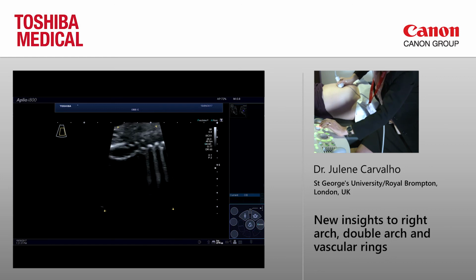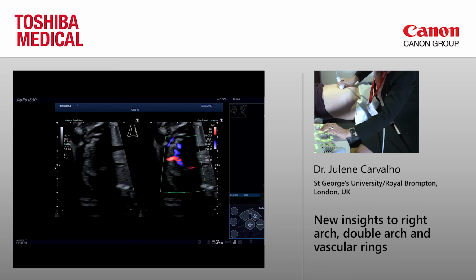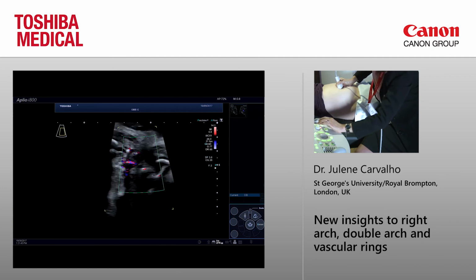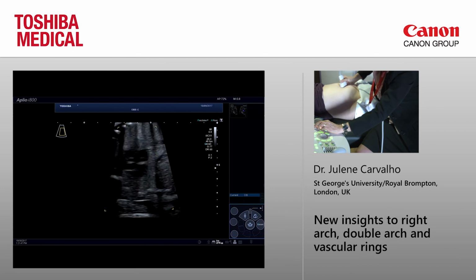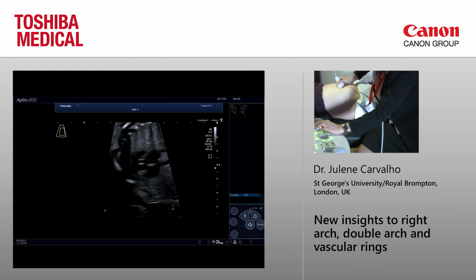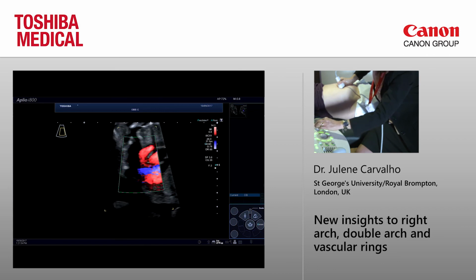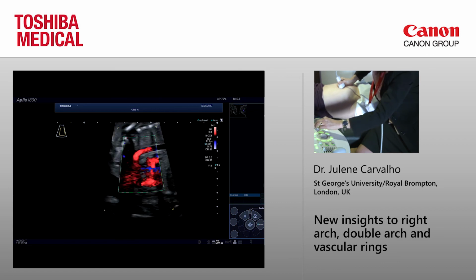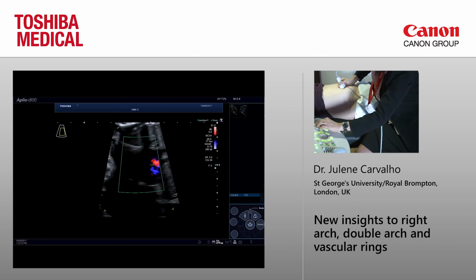That's our aortic arch. Baby's moving. So the baby moves a lot, and then you get a lot of artifact with the high definition. So that's nice aortic arch.